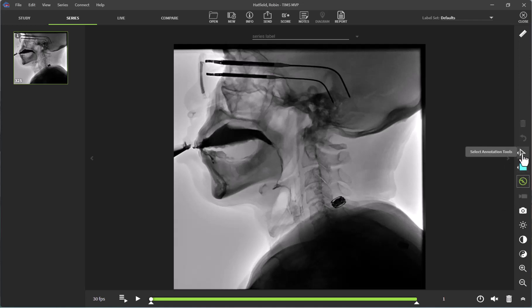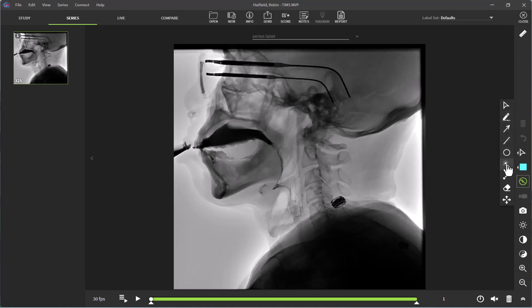To access the tools, we are going to click on our select annotation tools icon here. There are three tools available to measure bolus percentages: the freehand tool, the magic wand, and the magic brush.